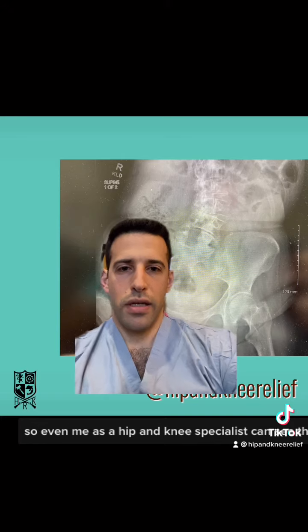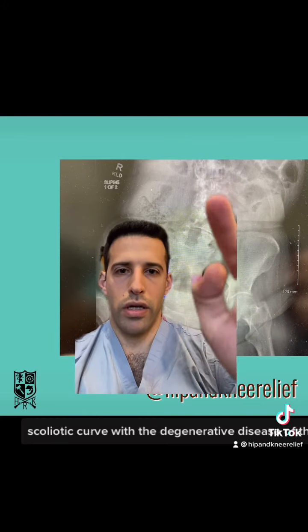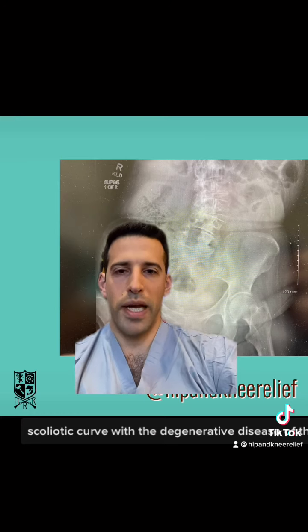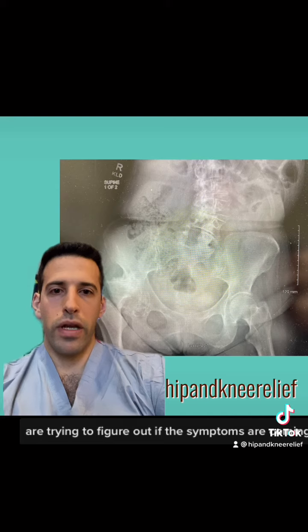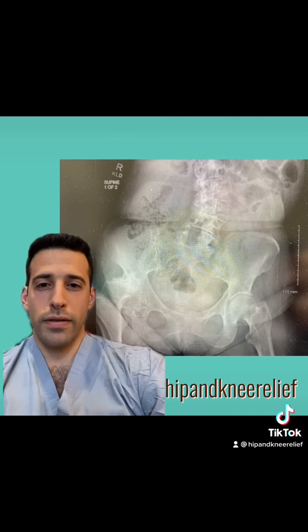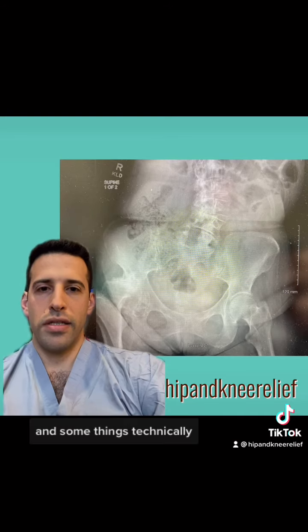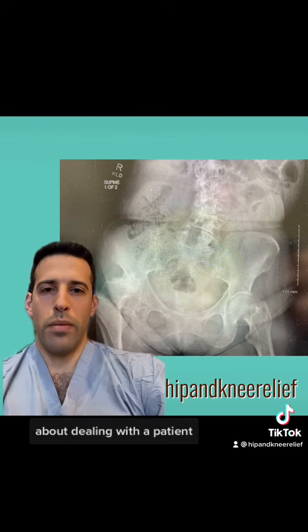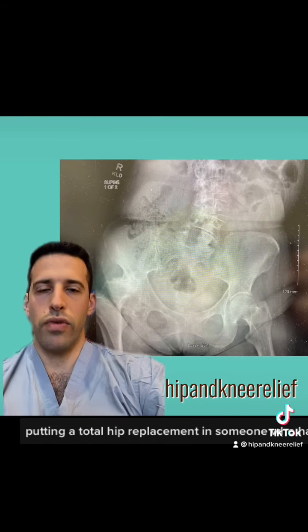So even me as a hip and knee specialist can see that there's a severe scoliotic curve with degenerative disease of the spine. So the things that are important for us as hip surgeons are trying to figure out if the symptoms are coming from the back or the hip, which is not always as easy as it sounds, and some things technically about dealing with a patient, putting a total hip replacement in someone who has a rigid spine.